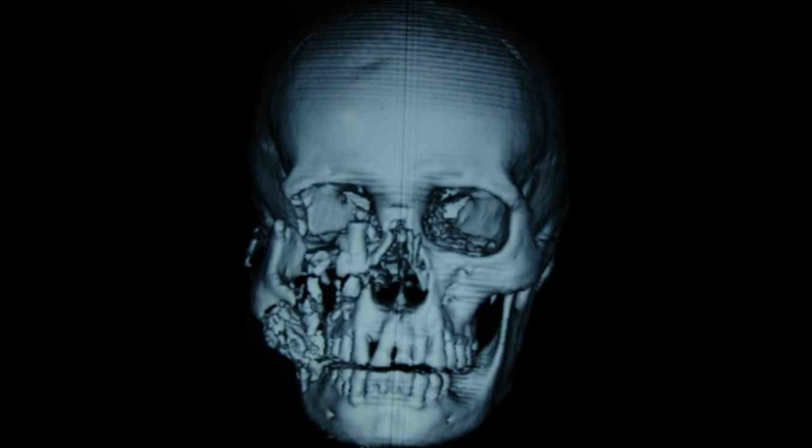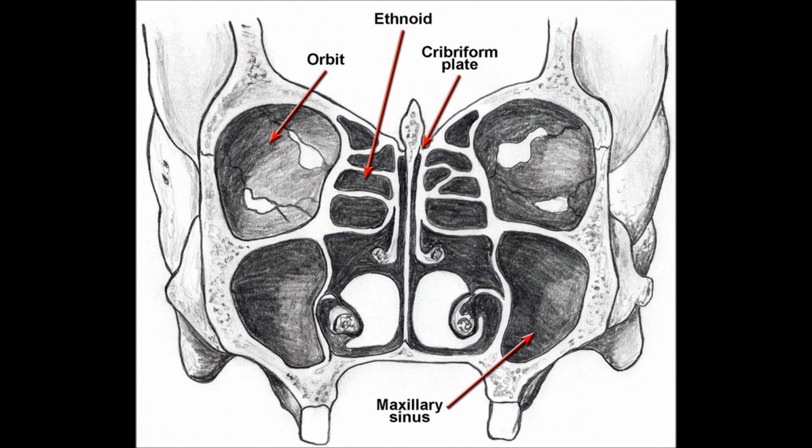So you are holding the NPA and you are ready to insert it through the nose of your patient. What must you really remember? Make sure that your patient has no facial trauma. Why? Because of the risk of misplacement into the cranial cavity through a fractured cribriform plate.